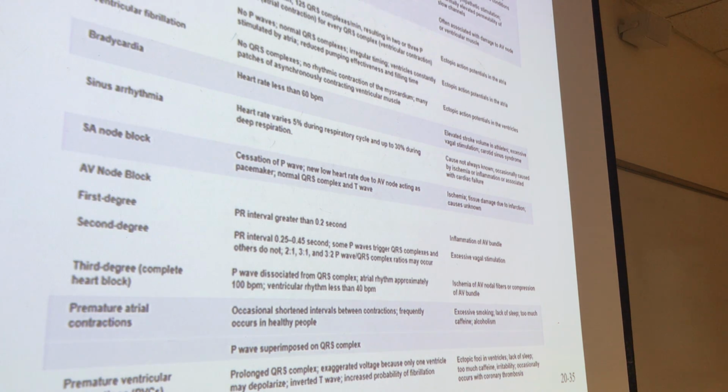And this kind of explains everything here. Again, with tachycardia, the big thing is this one. If there's a heart rate in excess of 100 beats per minute at rest, right? At rest. That's what they should put, at rest. Because if you're exercising and your heart rate isn't at 100, yeah, you're not really doing much. So at rest, that's tachycardia, greater than 100.